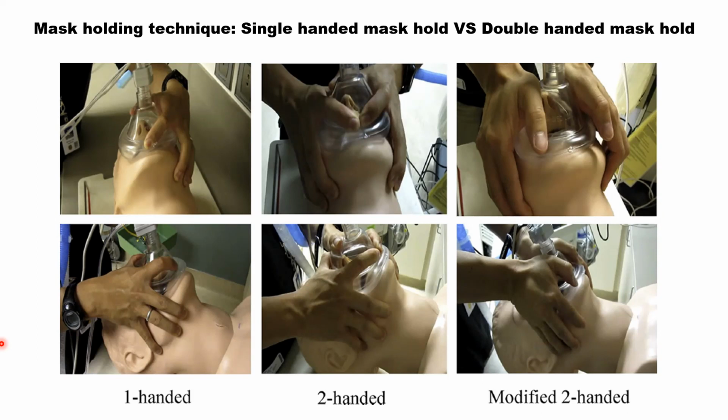If you don't do it properly, the requirement is that your airway has to be patent first of all. You can get the seal tight, but if your airway is not patent, meaning you have not opened the airway, you do not perform an airway maneuver, you only ensure the seal. That is not good enough. That's not going to get the air in.